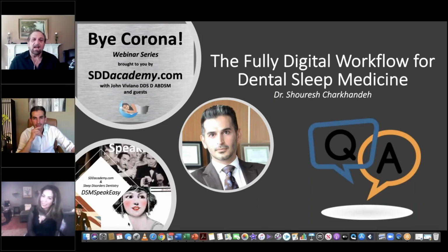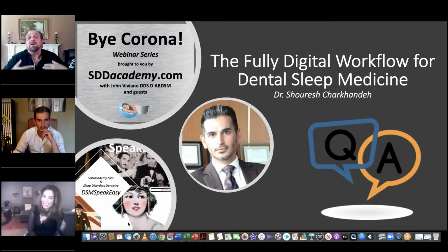That's the problem. For a bigger guy with a bigger tongue, I would tend to go with more vertical to allow more room for this massive tongue. And for a more petite lady, I would go with a lower vertical. So regardless of the position the matrix would put me at, I would then use the vertical when I take my bite, using that information as well. That's what I do, for want of a better way to do it.